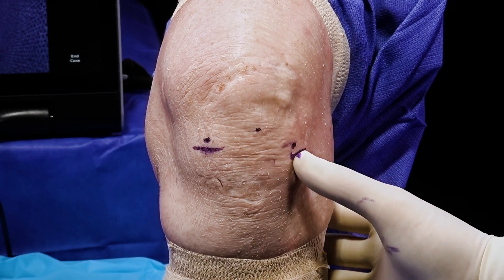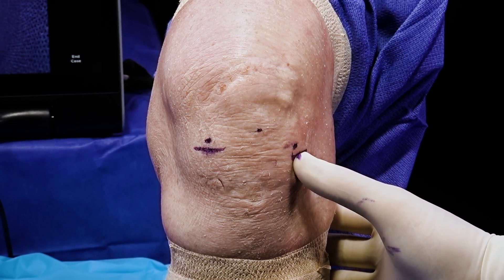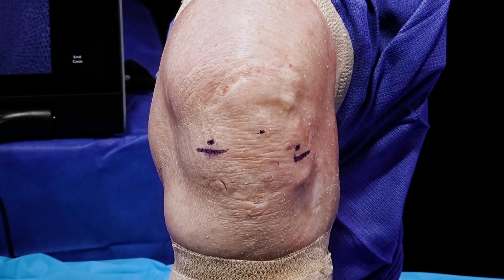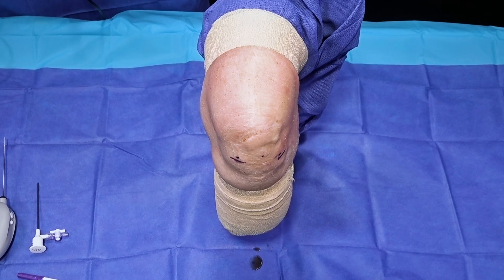Here is our lateral arthroscopic portal. This is going to be our standard visualization portal. And here is the standard medial portal, which will be the working portal for a lot of our arthroscopic procedures as we get to the therapeutic aspects of nanoarthroscopy. We also have other portals at our disposal — a posterior medial portal can be utilized, as well as a standard superior lateral portal if you need to get better access to the patellofemoral joint.